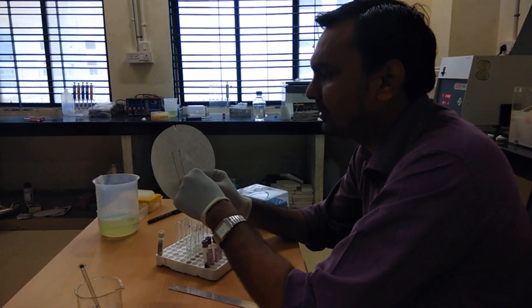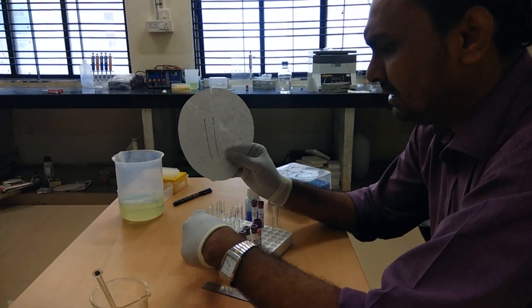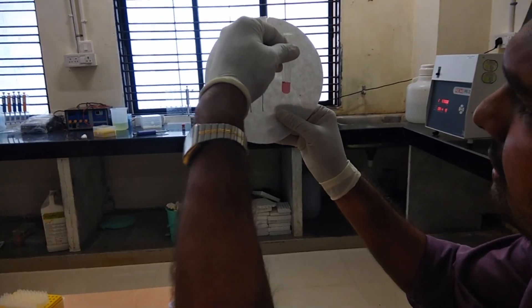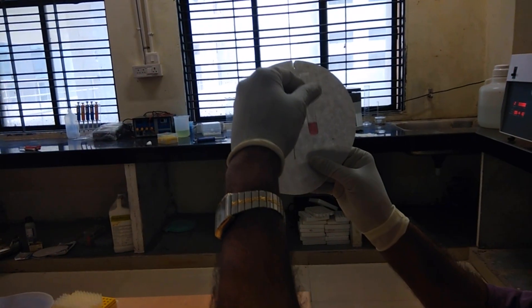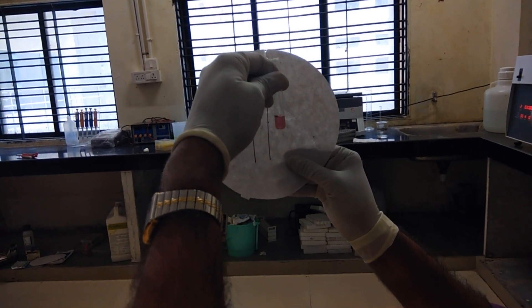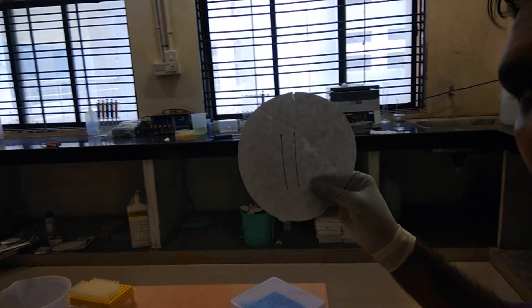I have drawn 2 parallel lines, 2.5 centimeters from each other, and I have to see whether the lines are visible through the solution or not. This is an unknown sample and we can see the 2 lines through the solution — so it is transparent and the solubility is negative. This patient is most likely normal.